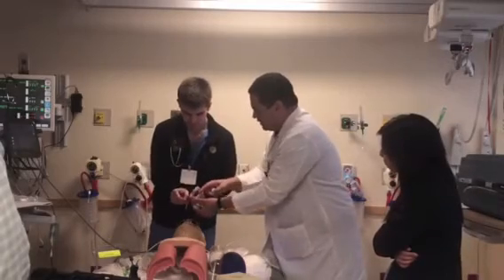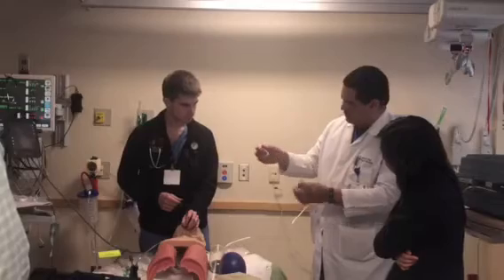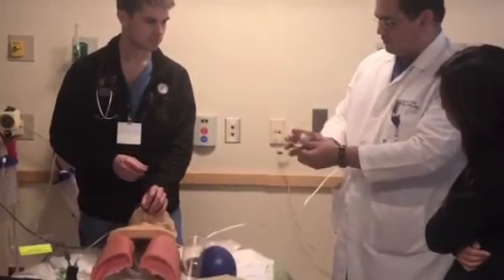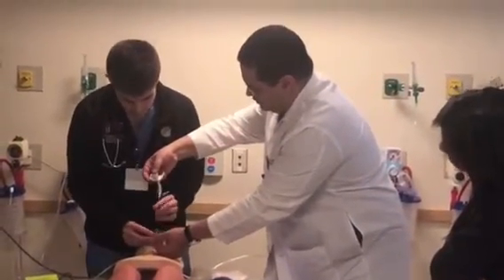All right, so assume that this is in the airway now, right? Here, this is a wire and a dilator at the same time. And this is the tube. We're going to put it through like this, and we're going to put this through. So I'll hold the needle, you put this through.